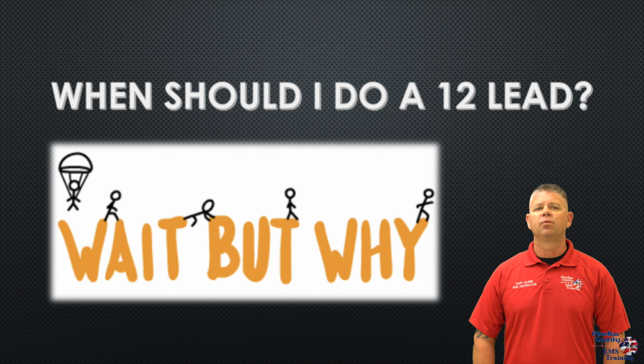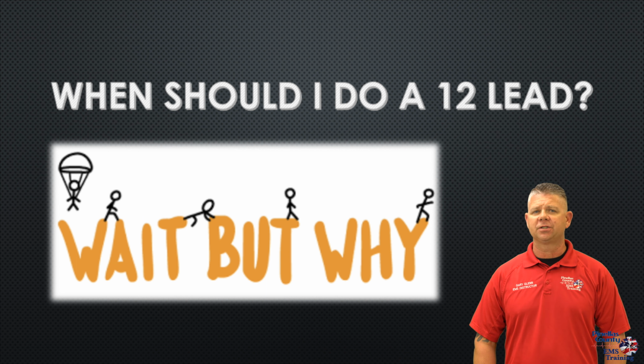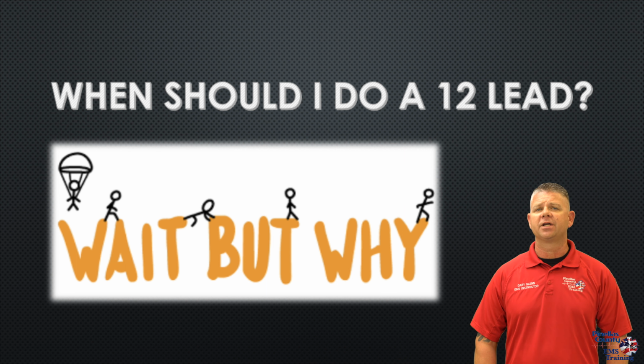Okay, so we're going to discuss when we're going to do a 12-lead EKG. The following patient should receive a 12-lead EKG: anybody with difficulty breathing, syncope, palpitations, unexplained nausea, any patient who's complaining of an unease feeling, diaphoresis, any unexplained jaw, arm, epigastric, or shoulder pain. Any patient that we get ROSC on after cardiac arrest, after epinephrine administration, and after nitro administration, we want to do a 12-lead as well.